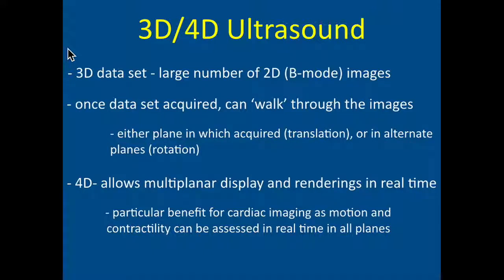Conceptually, I always find that I'm stuck at square one with explaining the idea of what a 3D, 4D ultrasound is to people. And really, it's kind of like thinking of a series of 2D or super thin slice B-mode images that are taken in succession. I'm old enough to remember, and hopefully some of you are, where we had those little books that you could flip through, which were all discrete pages, but as you fanned through them, it appeared to look like a movie. That's really the best description of what a 3D data set is that I can give you.